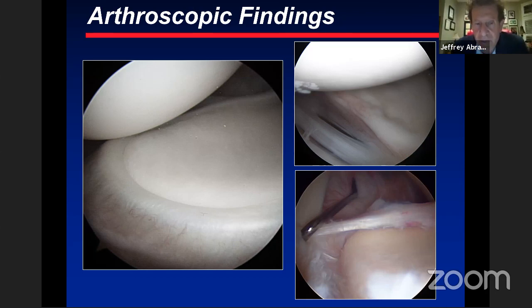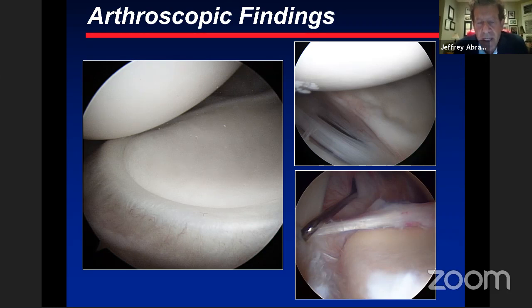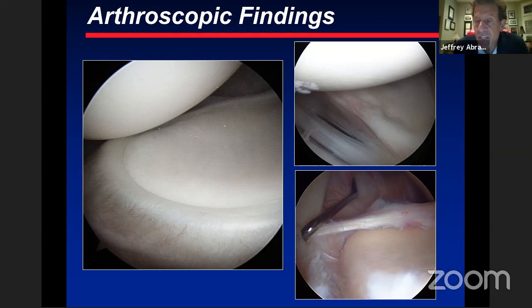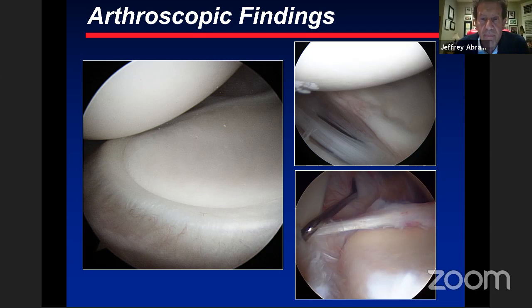It's interesting how many patients, when you put the scope in, have very little damage — just a small labral rent underneath the humeral head, not enough to call it a Bankart lesion. There can also be a deficient capsule of tissue. We also see SLAP lesions or superior labral tears, and that's what we found on diagnostic arthroscopy in some multidirectionally unstable patients.